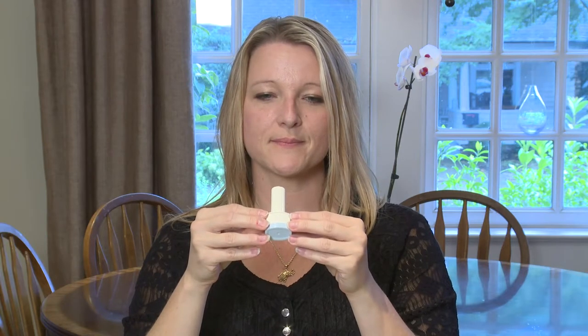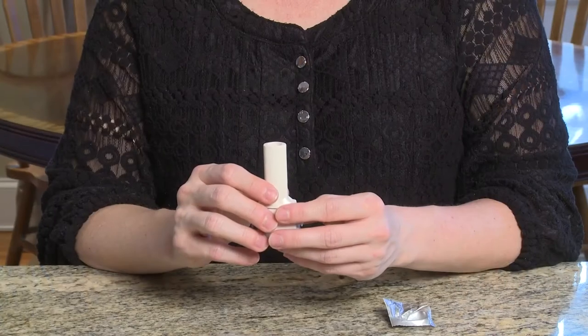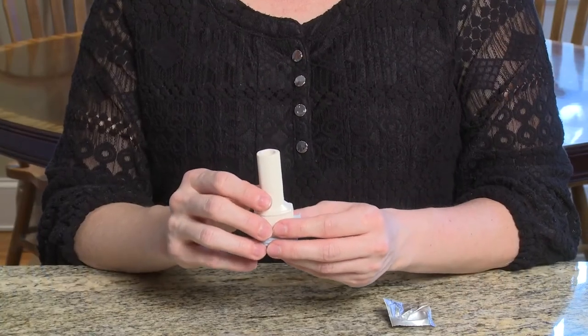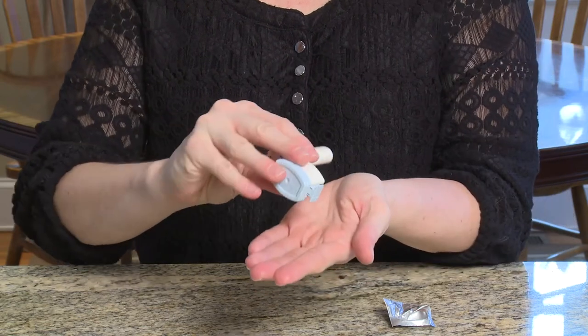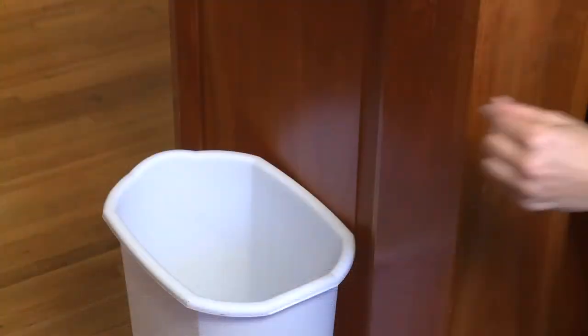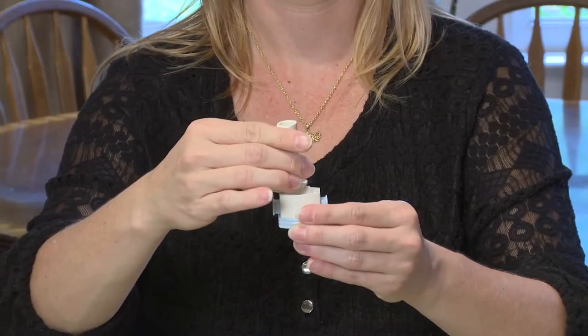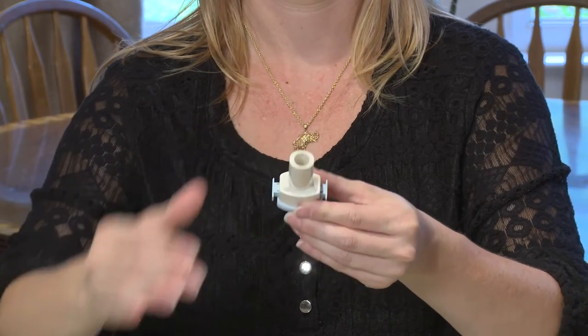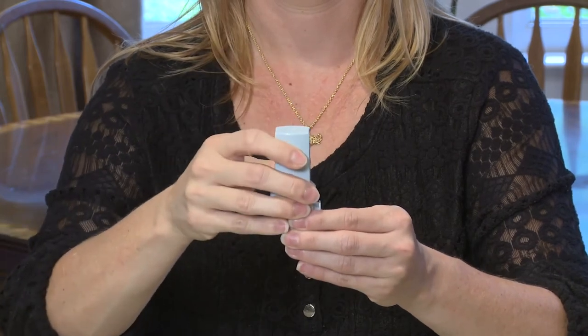Hold your breath for five to ten seconds after each time you breathe in. This lets the medicine go deeper into your lungs. After you have finished your treatment, throw away the empty capsule. Open the mouthpiece and tip the neohaler into your hand so that the empty capsule can fall out, then throw it into the trash. Close the neohaler until the next time you need to use it. Hold the base firmly and put the cap back on the neohaler.